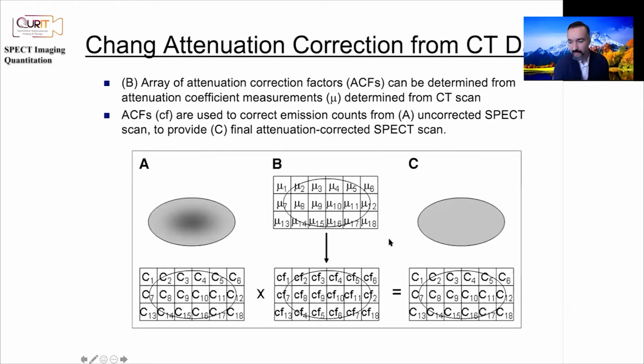And we have a question here about attenuation correction. Attenuation correction does not increase scatter. Attenuation correction allows you to see the effect of scatter. So before that, you had both attenuation and scattering, but the attenuation effect is more dominant, so it was kind of hiding the effect of scatter. When you corrected for attenuation, suddenly you started to see the effect of scatter. It was being covered up by attenuation. Once you correct for attenuation, the effect of scatter showed itself.